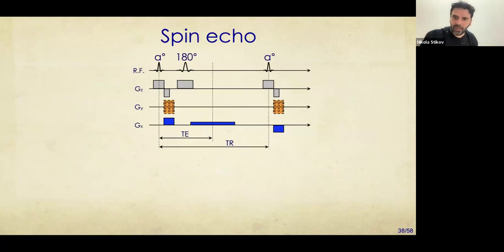The most important thing in this T2 mapping sequence is a protocol called spin echo. Now, understanding the spin echo is a little bit hard because what's happening is you have excited the magnetization into the transverse plane. But then there is inhomogeneity, a variability in the magnetic field that makes different kinds of magnetic vectors precess at slightly different frequencies.